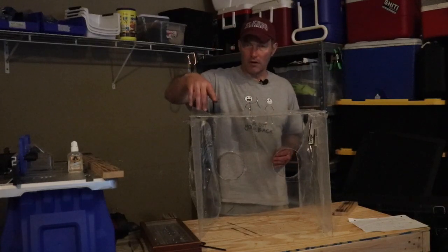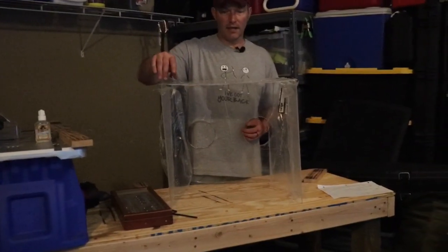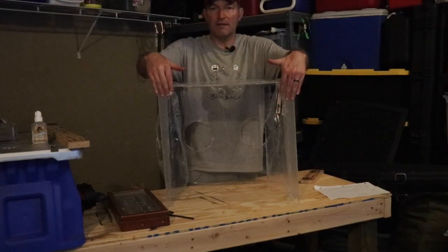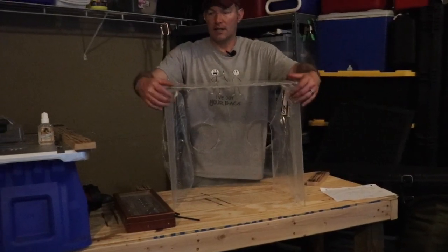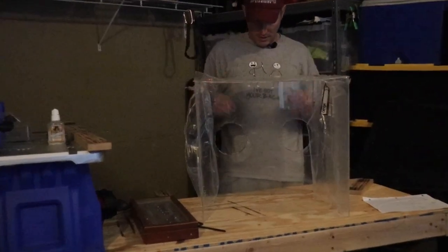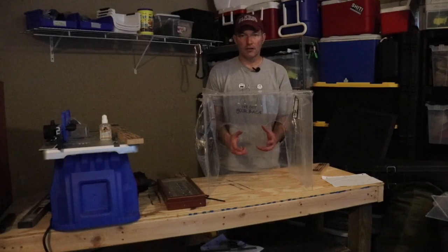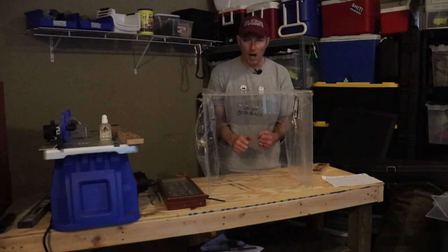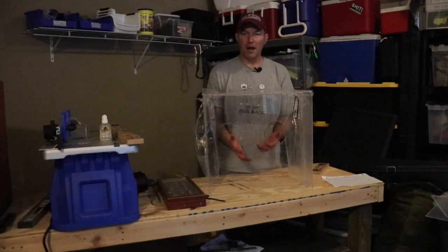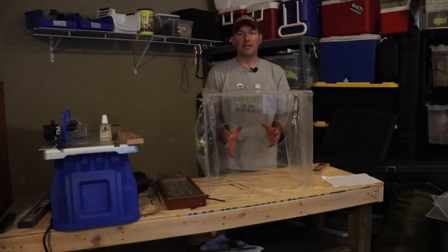Now, of course, if you're the OR nurse and you're standing there trying to help me when it's time to extubate, that's not a great thing. But I'll look and see. It's got a schematic for a little 5-inch piece that goes across the front right here. I don't know if it's absolutely necessary. I mean, this box is pretty sturdy. I feel pretty good. I can do a good head tilt, chin lift here. I could do a good jaw thrust. It might be a little awkward to intubate, but it's just like anything else, a little practice makes perfect. So I think it's a great idea. Hopefully you get the concept.